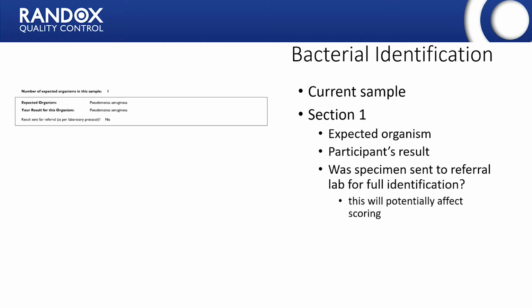Now, what does that mean? Well, basically, some labs are not kitted out to deal with certain strains, certain genus and species. So once they think it's heading down a certain line or certain organism that they're not set up to deal with, i.e., an organism probably with a higher biohazard level, then what they would do is send that out for a referral to another lab.